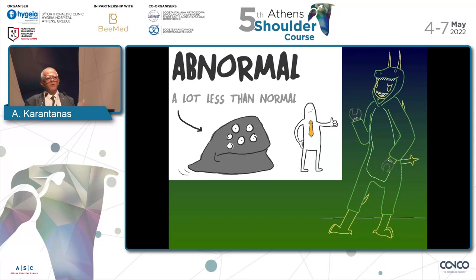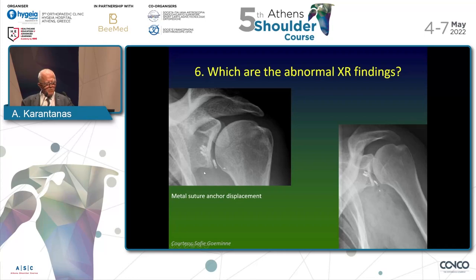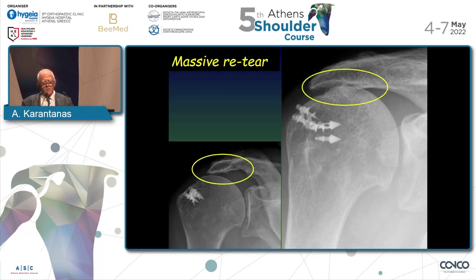Now let's move to the truly abnormal findings. On X-rays we don't have many abnormalities, but we may see displacement of anchors — here one is in the inferior joint space. A displaced anchor may cause significant erosions in the articular cartilage. We may also see intact anchors in the humeral head but almost zero distance between the acromion and the humeral head, suggesting a massive retear. There isn't much more we can do with plain X-rays.